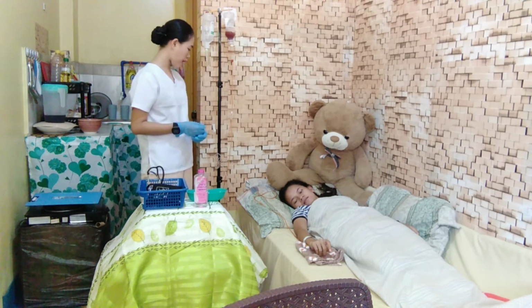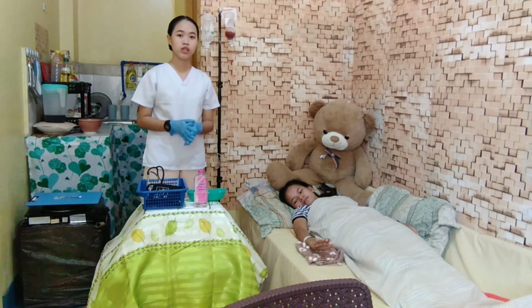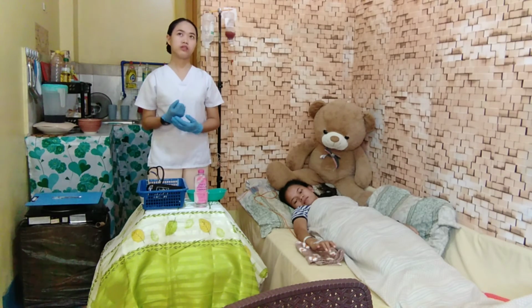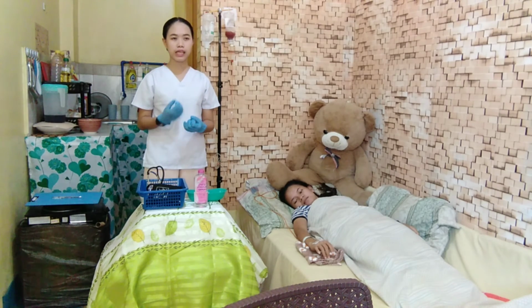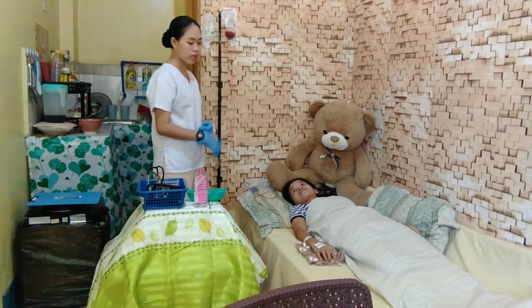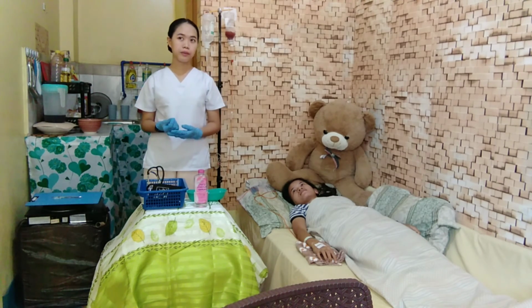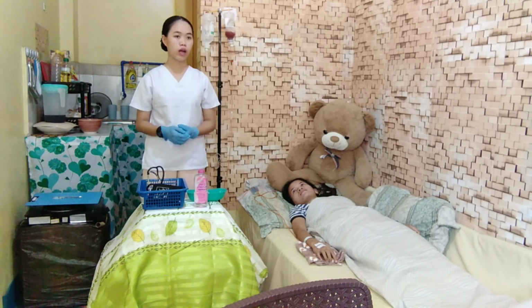After the administration reaches 4 hours, we will stop the transfusion. We will also stop the transfusion immediately if any reaction is suspected, and do not incorporate any medication. If you see that the patient has a rash or itching, or you suspect any complications, report it to the blood bank and also to the physicians of our patient.